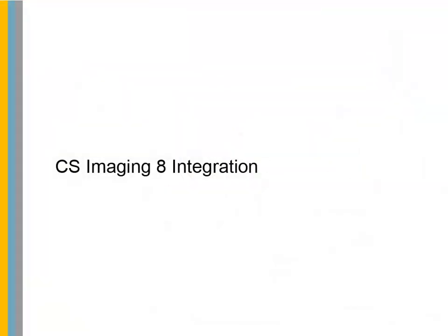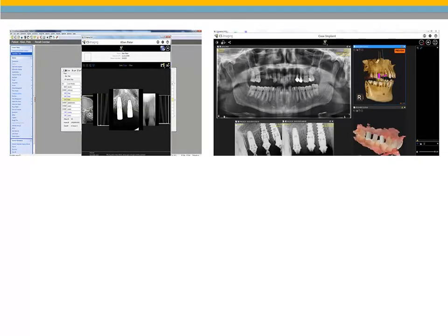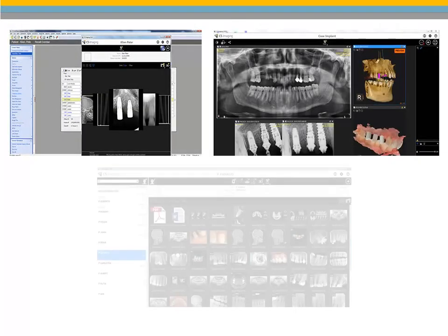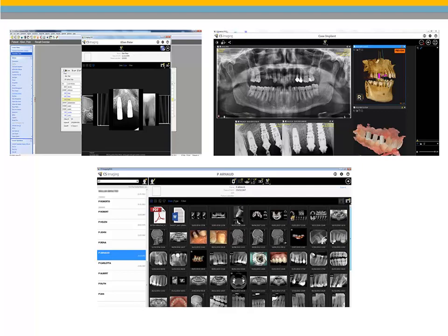CS Imaging 8 Integration. This version of Softdent includes the integration of CareStream Dental's newest imaging software, CS Imaging 8. Updates to the imaging platform provide one-stop access to all of your 2D images, 3D images, and CAD CAM data. A powerful dashboard image gallery is now available, along with a more modern user-friendly design, faster image review, and enhanced integration and installation.